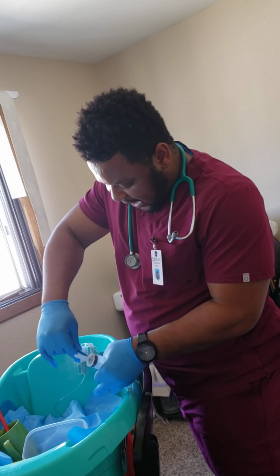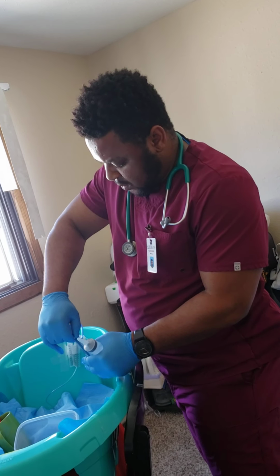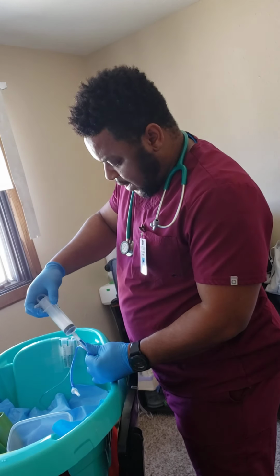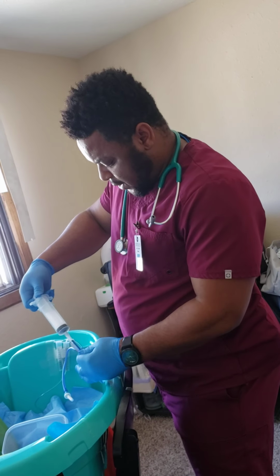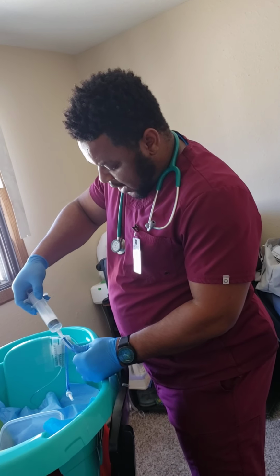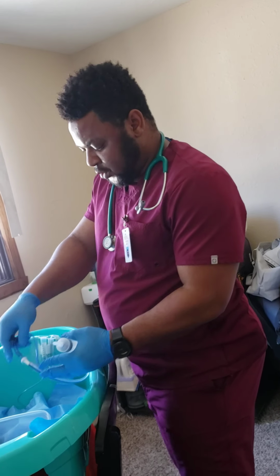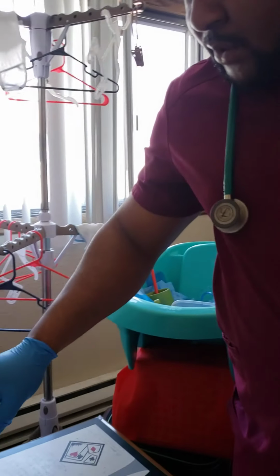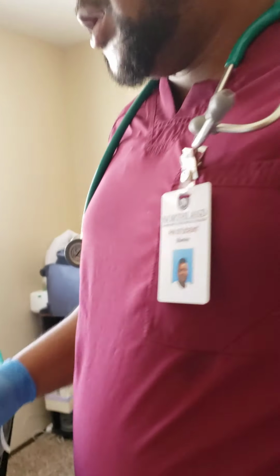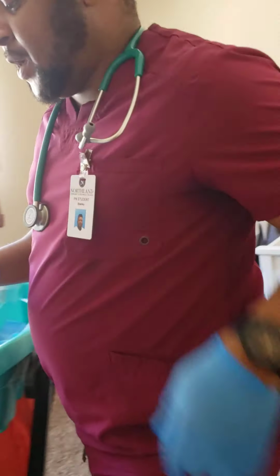So to do that, I will take this off. I'll first of all want to clamp. I'll clamp at the bottom. Then I'll take this off. Then I'll put my syringe right there, pull up, and allow it to pull up my aspirate. Then I'll clamp it back, take this off, and clamp my tube. Then I'll put my aspirate right in there and read the figure that it gives on my pH strip. I'll put this right back there.